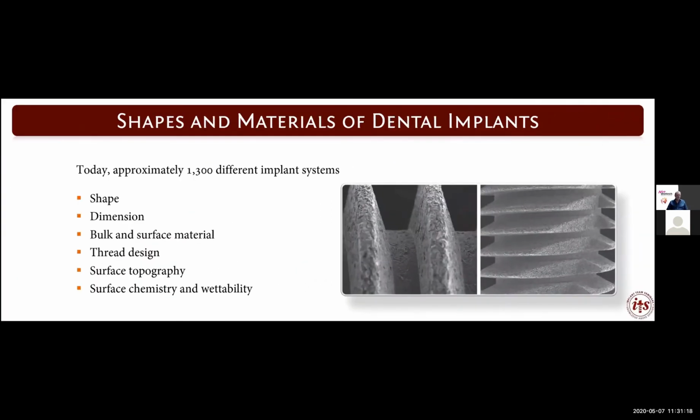As we see here, there are approximately 1,300, as of today's webinar, different implant systems. Surface characteristics like structure, wettability, and coatings contribute to the biologic processes during osseointegration by mediating the direct interaction of host osteoblasts in bone formation.